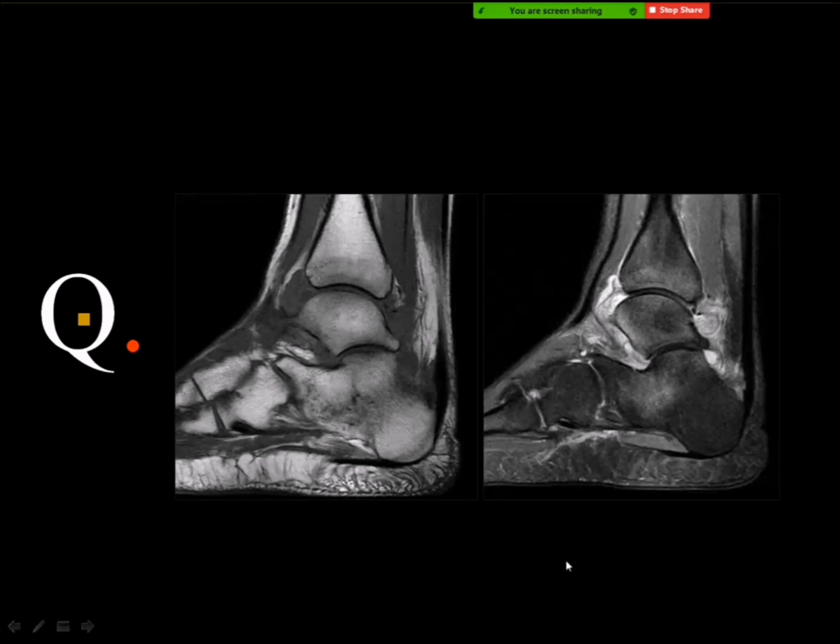Rheumatoid. Yes, and this is a rheumatoid ankle. Synovitis is one of the signs of joint infection, and hypertrophic synovitis is one of the criteria of rheumatoid disease, especially in this particular area. But if you do not notice these signs, you can say just this is synovitis, and it is considered the right answer.